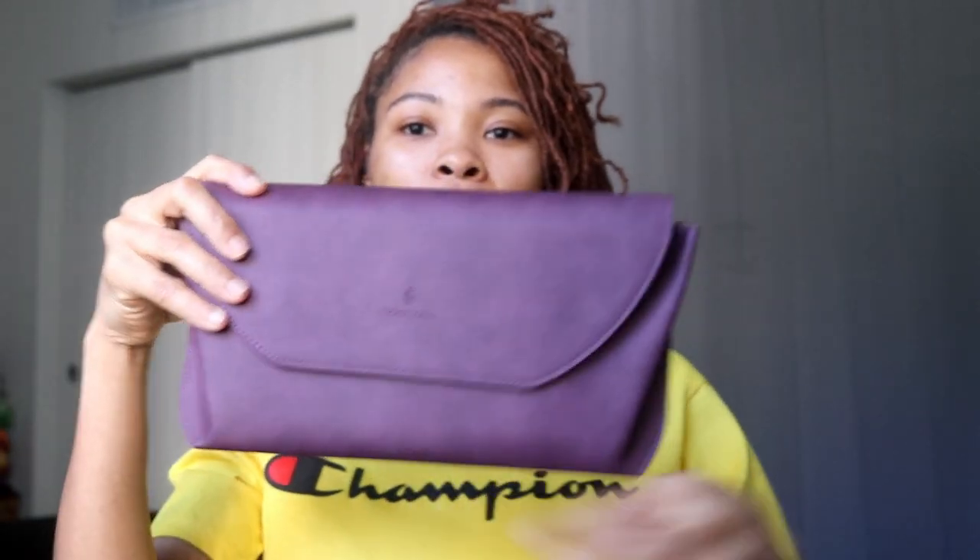This is so cute — it's like a little clutch, and it has 'Bjorn Hall' on it with the emblem. I'm putting the stethoscope inside the case. Look how chic, and it fits! I can like put this under my arm. I am just overwhelmed right now — this is bomb.